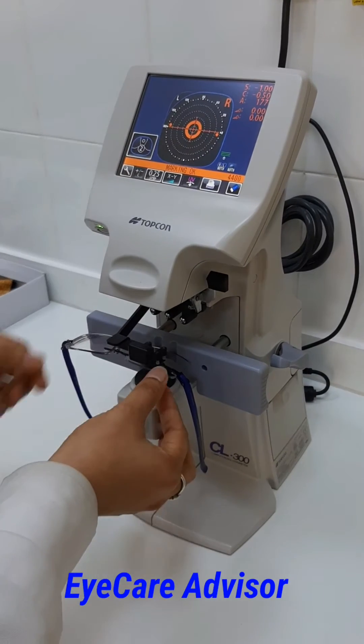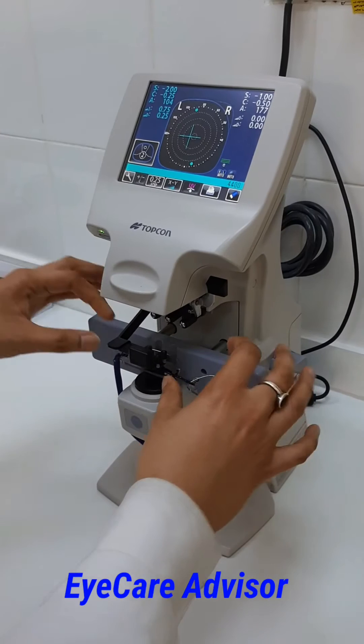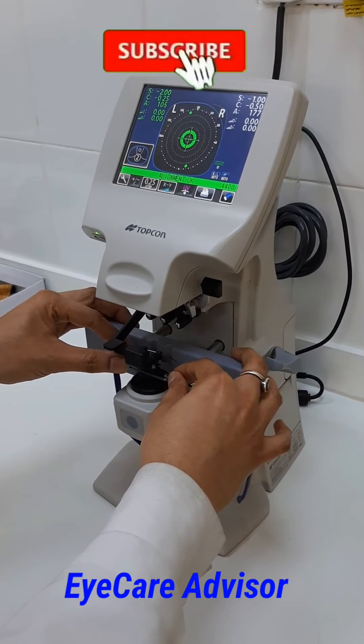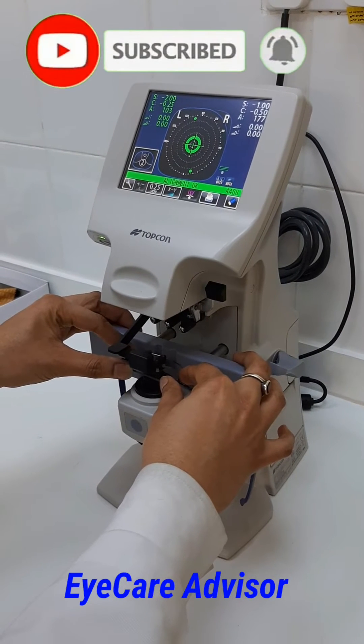So you get the reading — this is for the right eye. Then you just hold it, put it here, and now we will do it for the left eye. This will give a very accurate result. You just have to align it, and once you align it, the exact result will come.